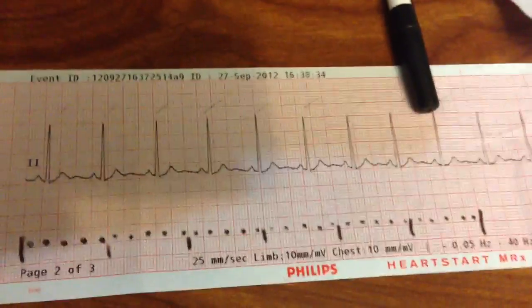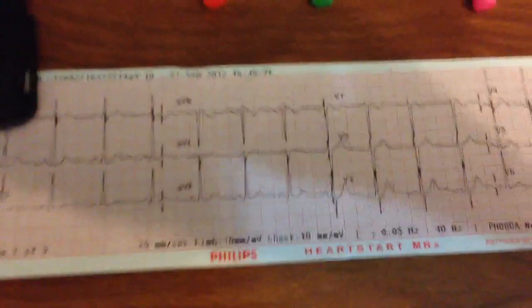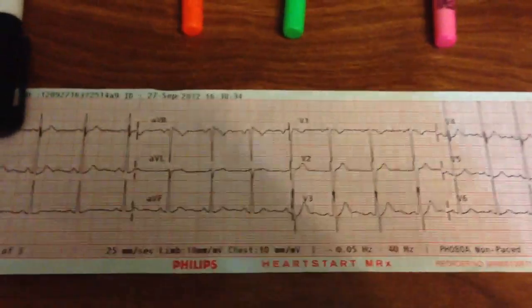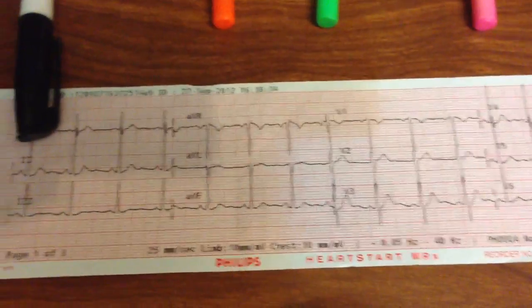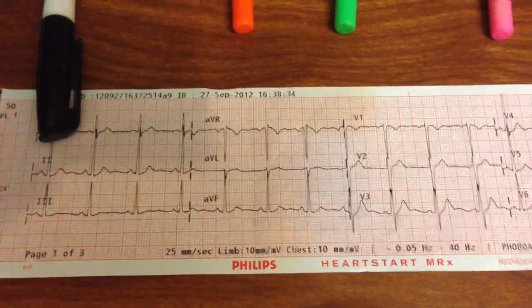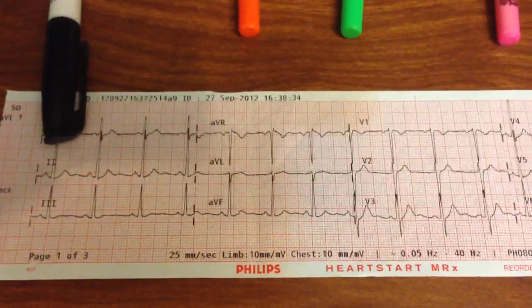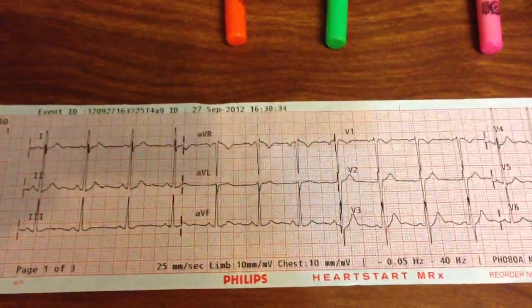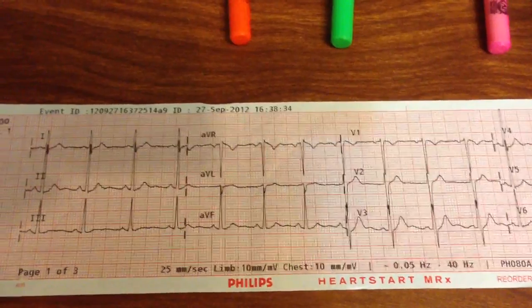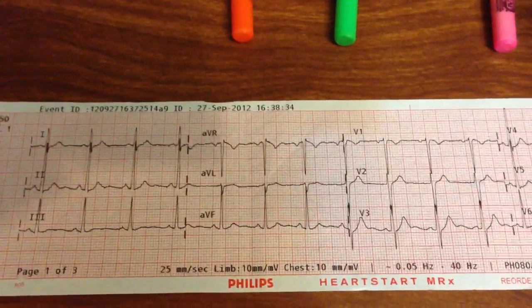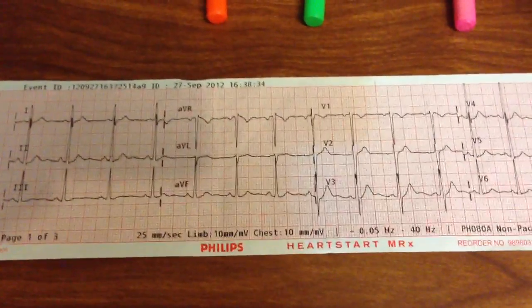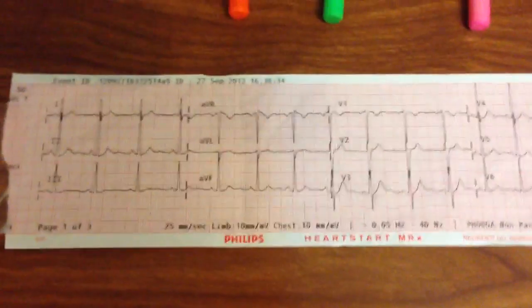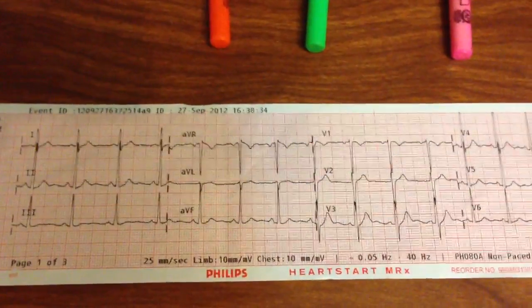Now I want to go and look at the 12-lead. What I want to identify are the major findings: ischemia, injury, or infarction — that's ST depression, T-wave inversion, ST elevation, or pathological Q-waves. In other videos we'll talk about more advanced concepts such as axis and bundle branch blocks.